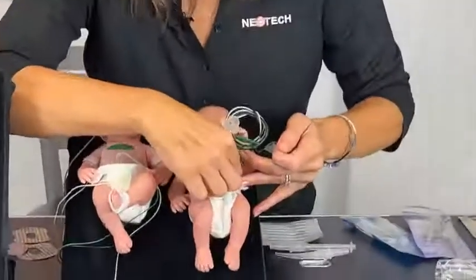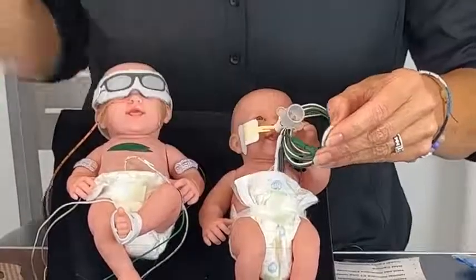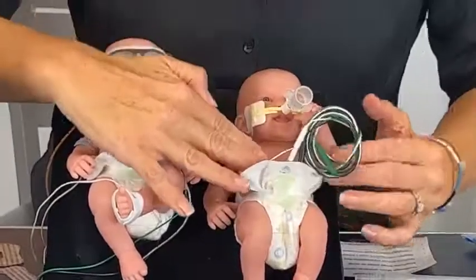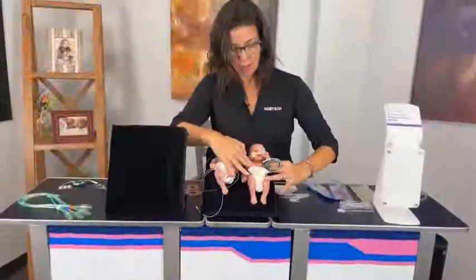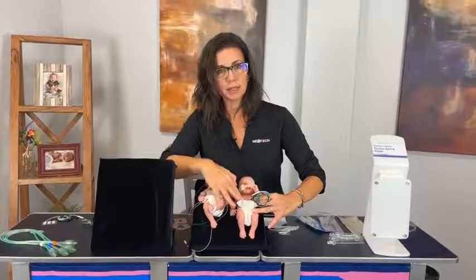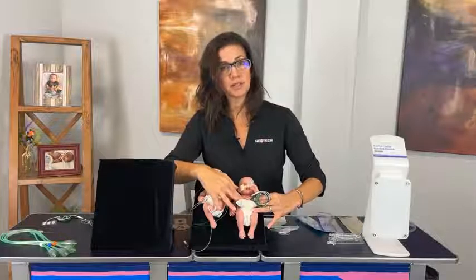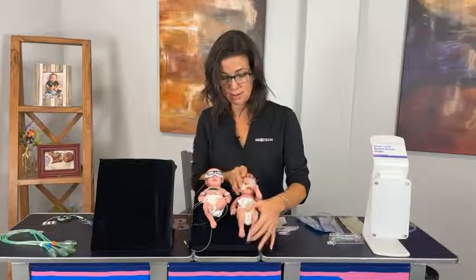After you've applied them, you're going to want to hold them in place for about 60 seconds. This will help the product to set. Now I know this can seem like a really long time, but if you take the time now to do this step, you're going to save a lot of time in the future because you're not going to have to change these out as often. If you apply properly, our leads will last up to 5 days. Okay, and then that is that.